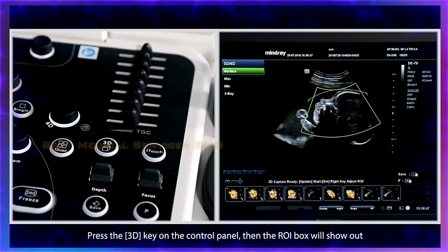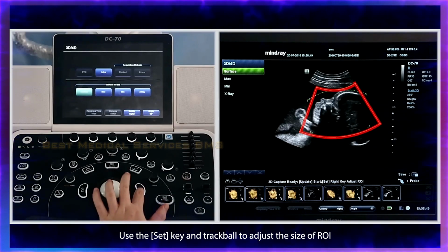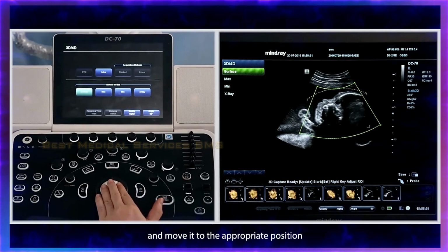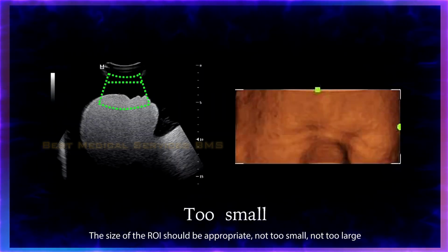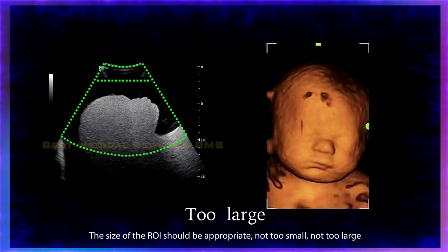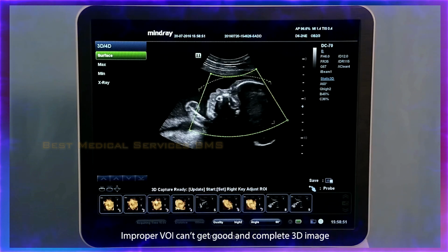Press the 3D key on the control panel, then the ROI box will show up. Use the Set key and trackball to adjust the size of the region of interest and move it to the appropriate position. The size of the region of interest should be appropriate. Not too small, not too large. Move the region of interest to contain the whole fetal head without any blockage. Improper volume can't get good and complete 3D image.